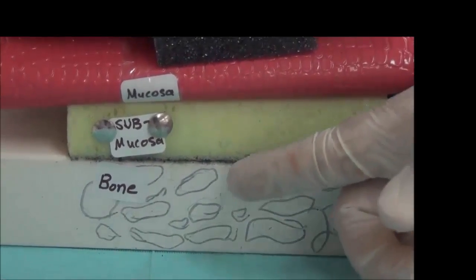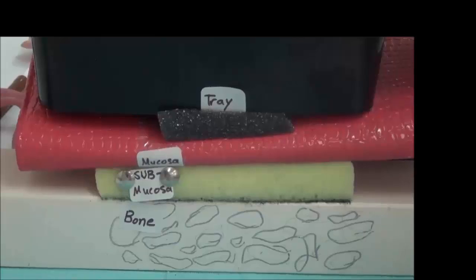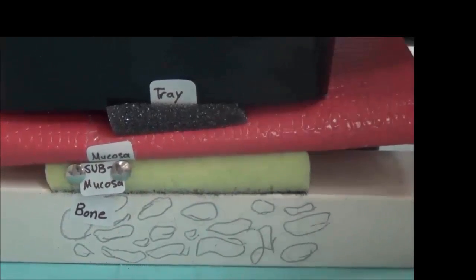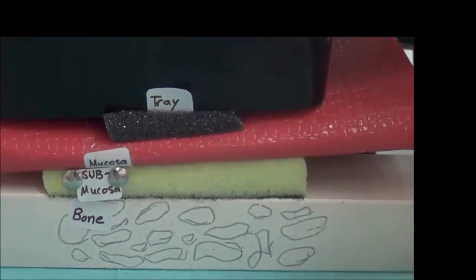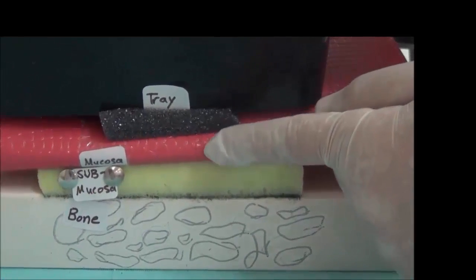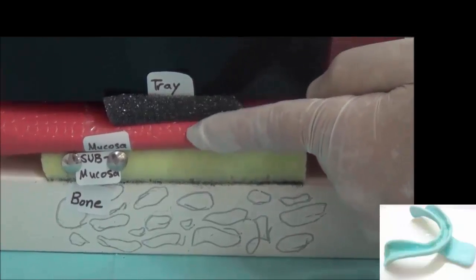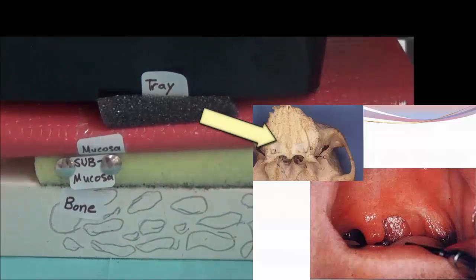So if we take the bone, submucosa and mucosa, and impression material and the tray pressed all together, this is called muco-compressive impression material, and the status of the tray is closely fit to the mucosa before adding in the impression material. And the tissue status underneath is compressed. So that's why we call it tissue compression method. This can be once more done with a tray that has no spacer in that area. The impression material is squeezed between the tray and the mucosa. The mucosa has some compressibility, and the bone itself could withstand such pressure.